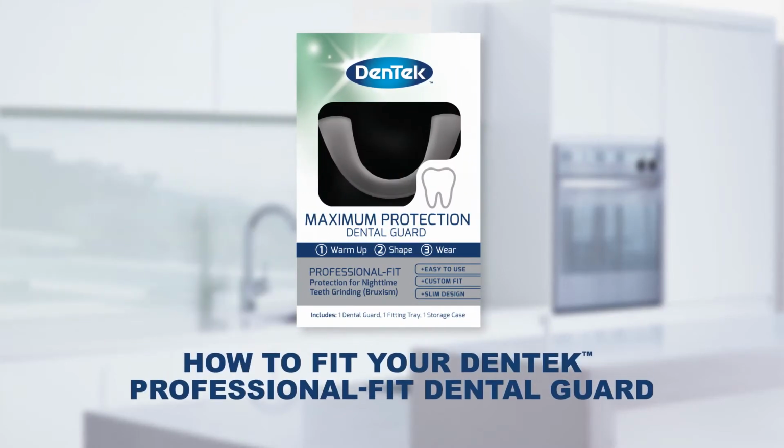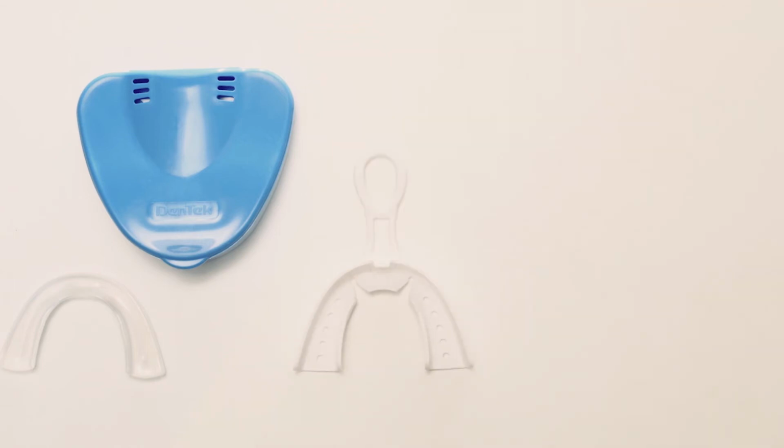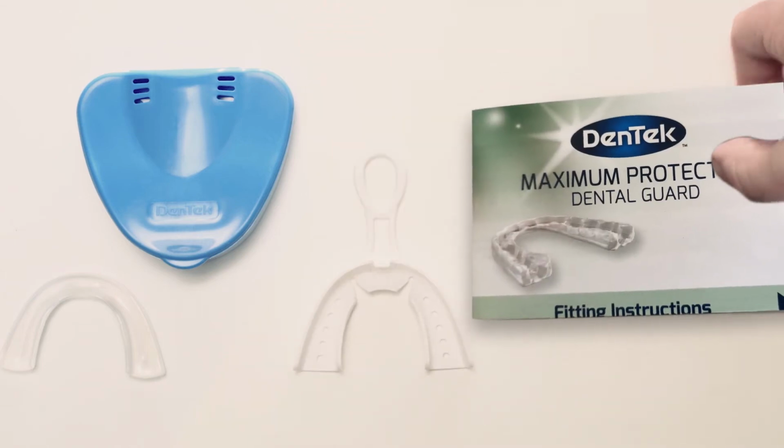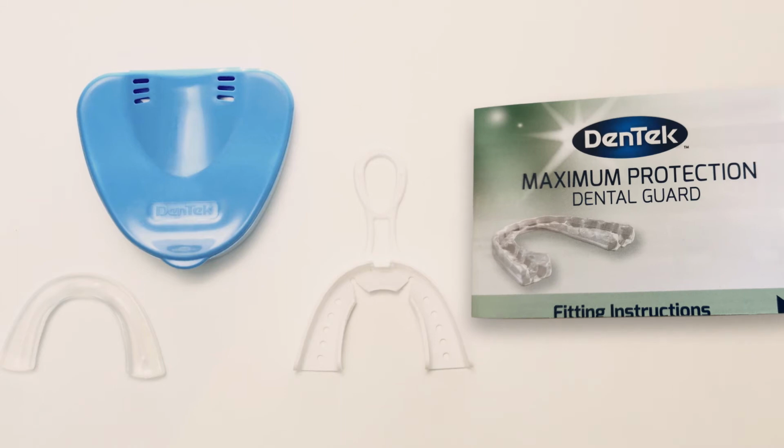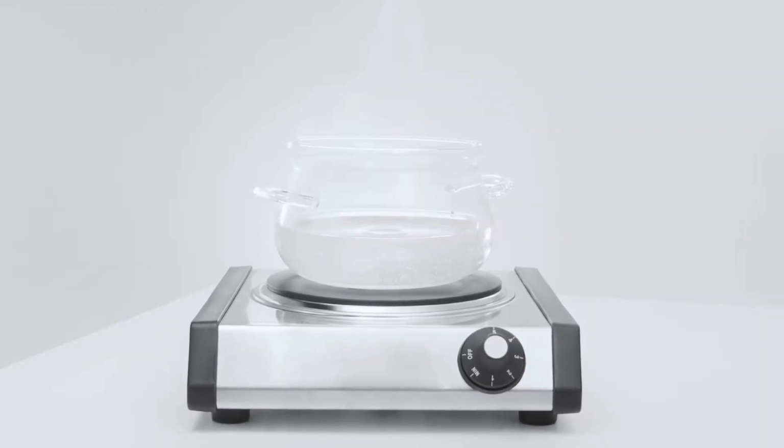How to fit your DenTek Professional Fit Dental Guard. This video will show you how quick and easy it is to get a professional fit in just a few simple steps. First, read all the instructions and warnings and watch the full video before you begin to fit your guard. The preferred method is to use a stove and a pot of water.